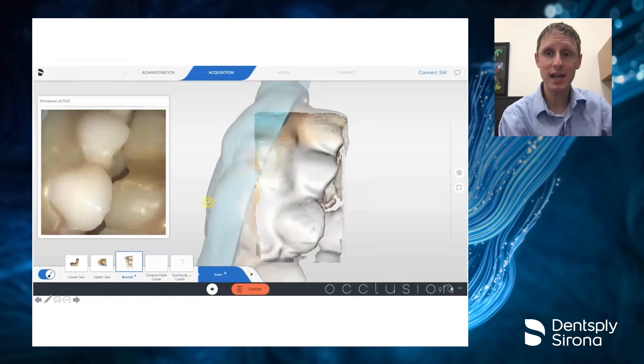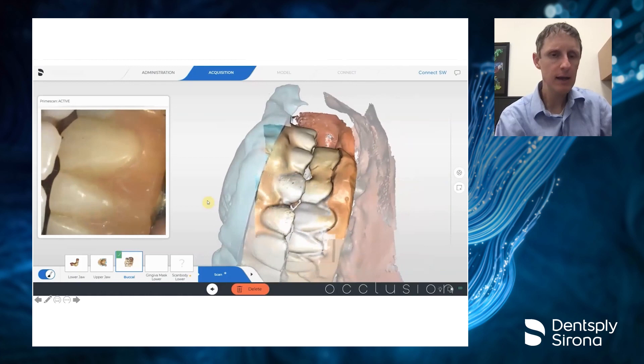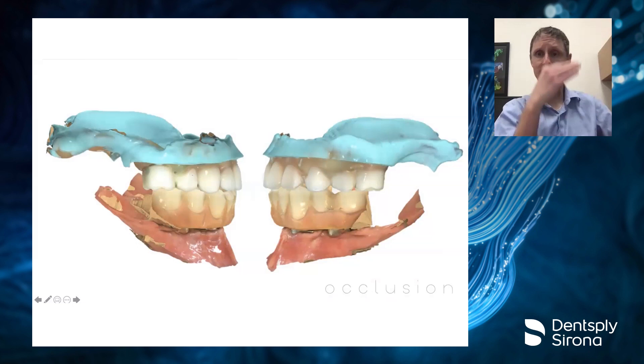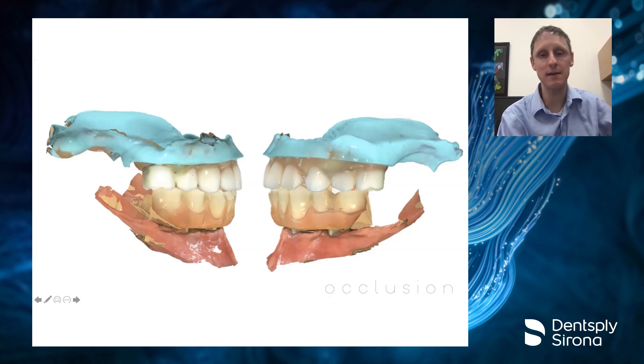The final thing we scan with both prostheses in is the occlusion — in CR or whatever you want to build the patient in. The great thing this does for you is that because we've set it up this way, all the models will come in at this exact same vertical and exact same occlusion. Everything will be cross-arch mounted in that exact area, which makes our lab partners' lives way easier.